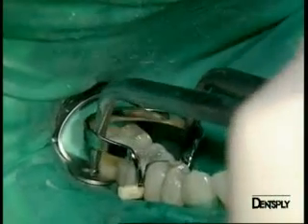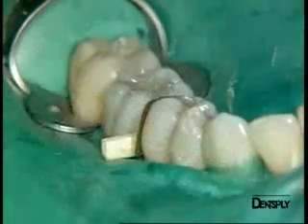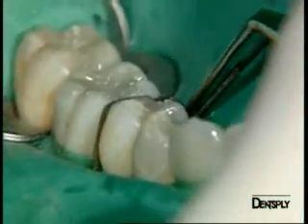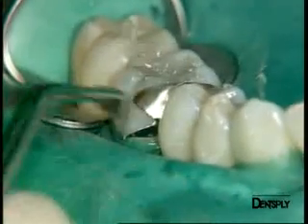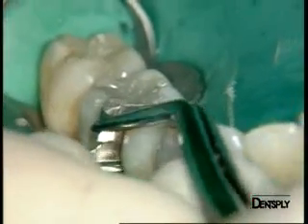Finally, we remove the matrix system — starting with the ring, then with the wooden wedge. We remove the matrix by pulling it sideways with tweezers. Here we see that it might even tear, which demonstrates that we have created an excellent interproximal contact.